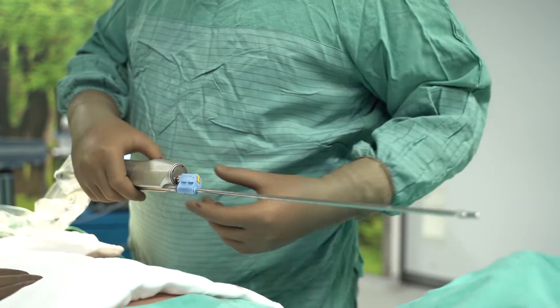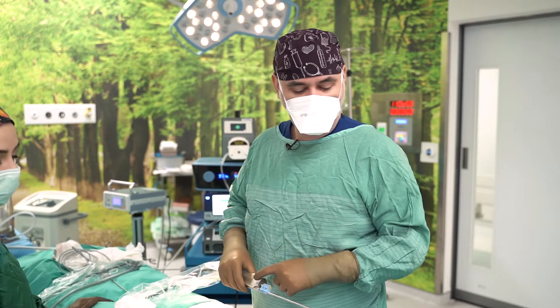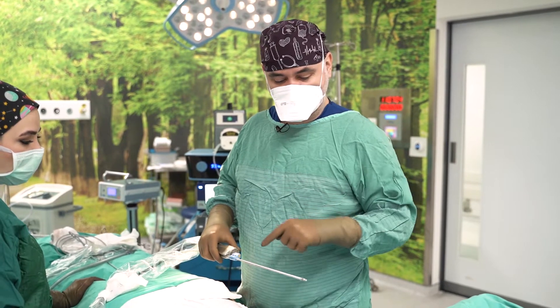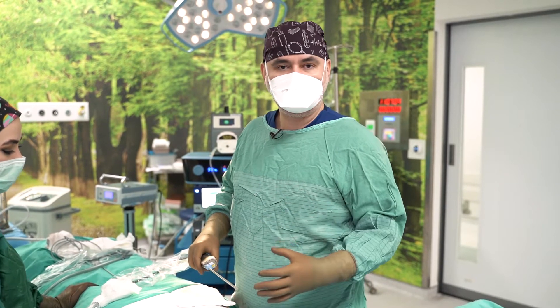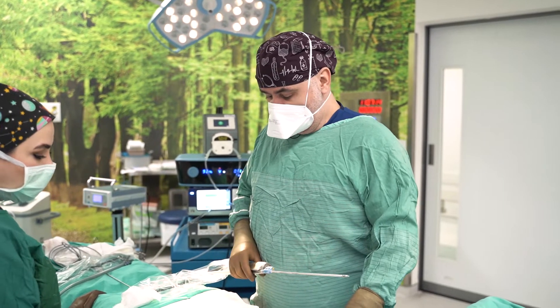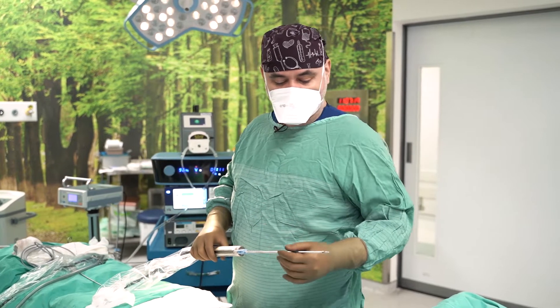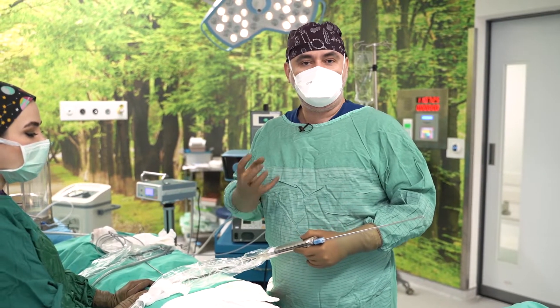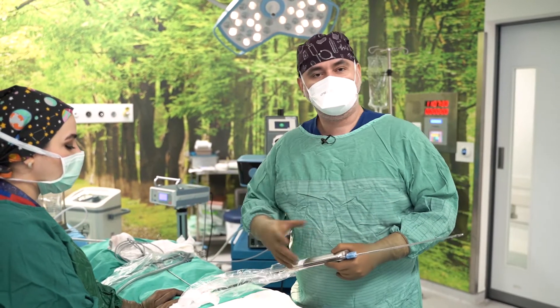Now we have finished the laser application and melted the fat. We will aspirate the fat with the micro air. The micro air is a power-assisted system and it causes this kind of vibration. With this combination of laser and micro air, our aim is to get a smooth appearance on the operation field. Now I will aspirate the fat with the micro air, collect the fat, then separate the fat from the blood and fluid to gather pure fat, which we will inject into the hip and butt region.